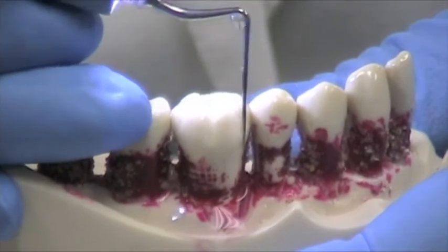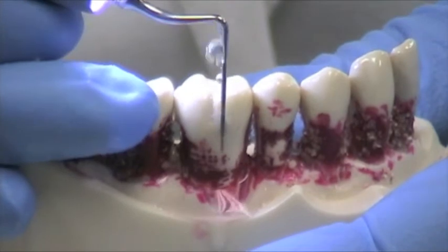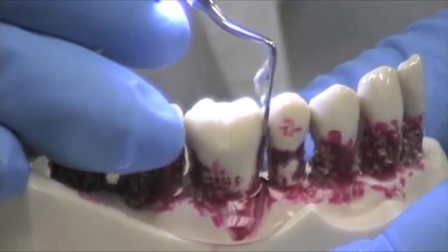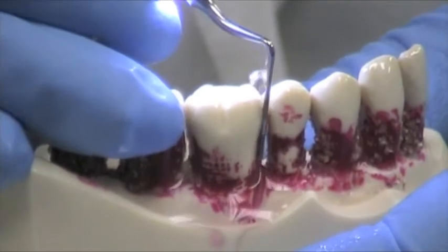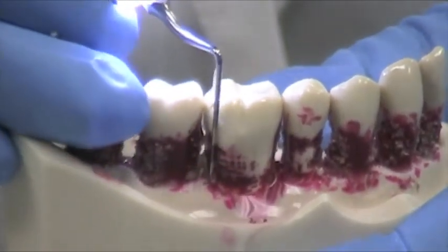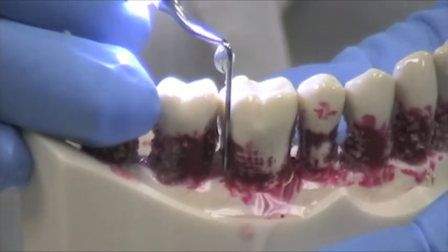You're really just doing biofilm disruption, not removing calculus. When I'm training hygienists and they say the calculus isn't coming off, I'll ask what tip they have — and often it's the wrong tip for that job. Drop by drop irrigation, running along slowly and methodically, going into the interproximal areas. The demarcations are helpful — if you have a 7mm pocket, you have a rough idea if you're getting down to the base. There are times when there are slivers of bone loss just the width of a periodontal probe. This tip is great for that — you just place it down in that pocket and don't even have to move it; just let the technology work for you.